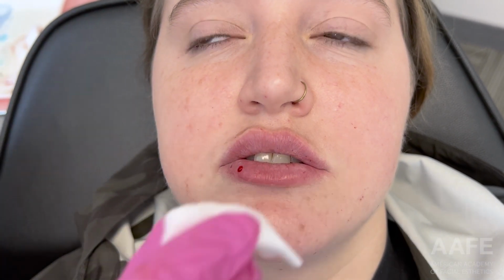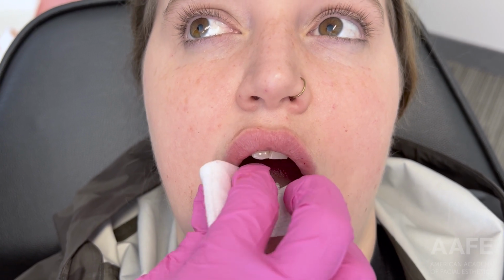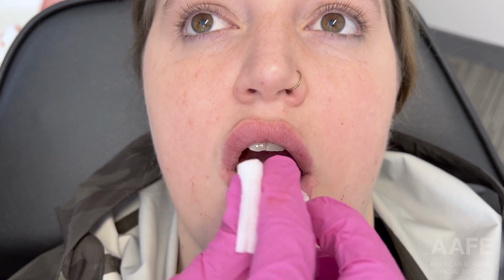Now I have some of that balm already. I'm going to give her one more feel, make sure that I don't feel anything that needs to be worked out. Sometimes when you put this balm on, of course you want to make sure they're nice and clean, no obvious blood. But sometimes when you put the balm on, it helps the bleeding subside. All right, so here we are. I have her all cleaned off. We have that one site that has given us a little bit of a problem, but nothing too big of a deal. I'm just going to put that there for 1 second while I talk to you about this.